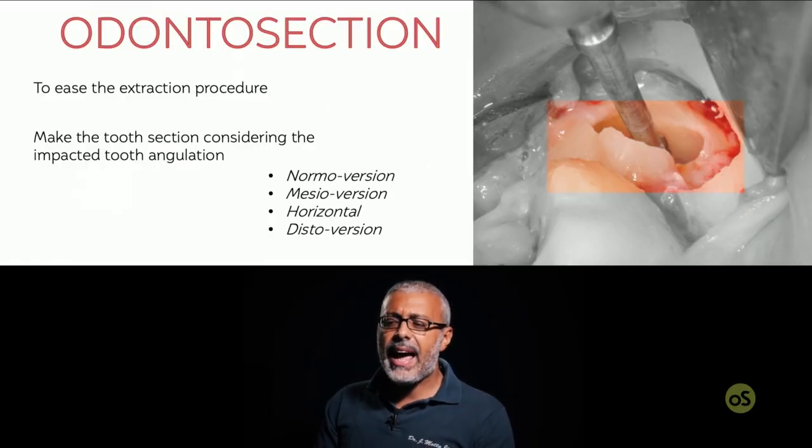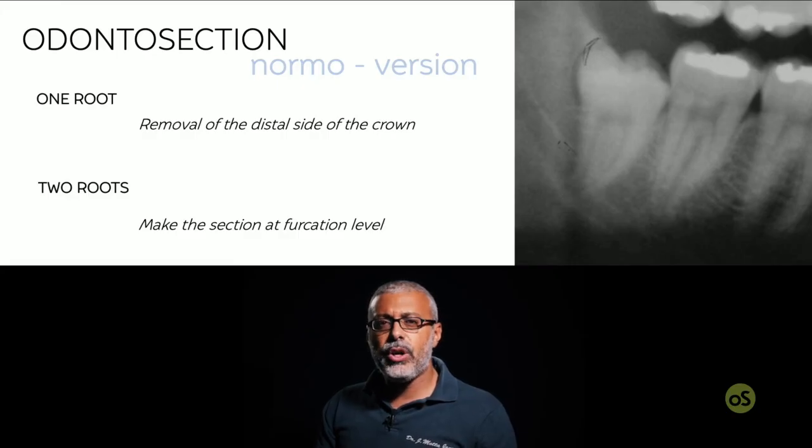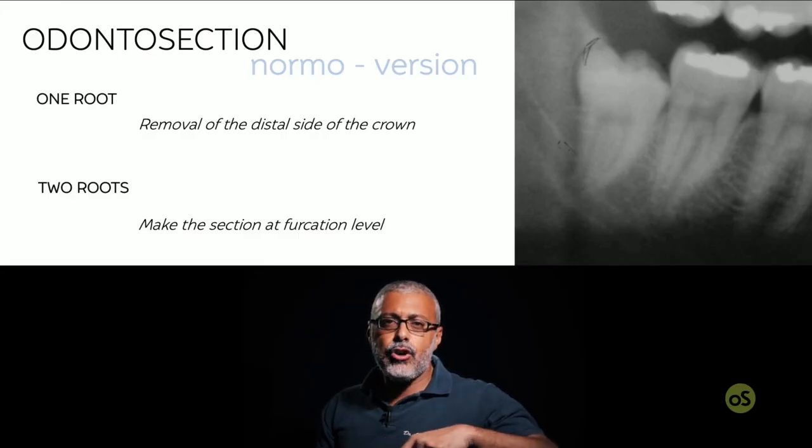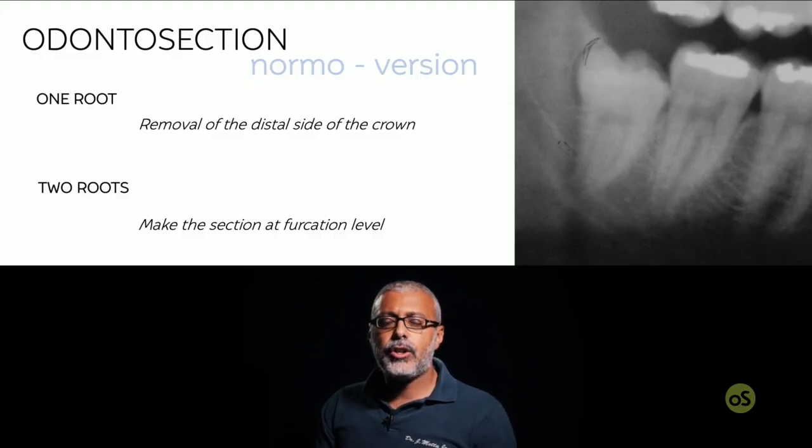We know that we have to do this kind of sectioning just cutting inside the tooth and not going outside of the tooth. We know that if we remain in the inner part of the tooth, we will not create any damage on the surrounding tooth. The sectioning of the tooth will be finalized with a lever, creating a direct fracture of the fragments we started to cut.